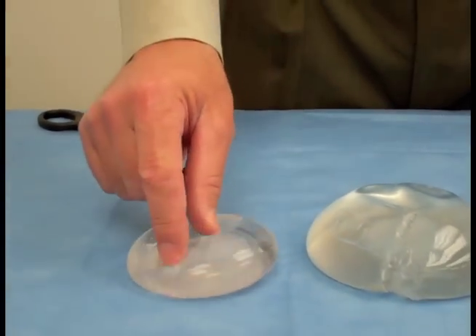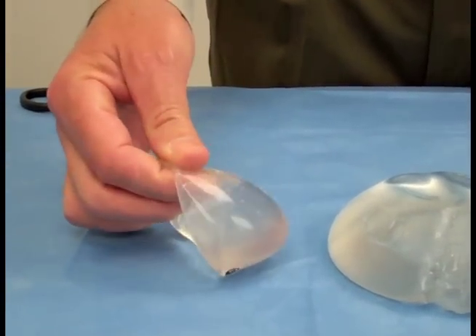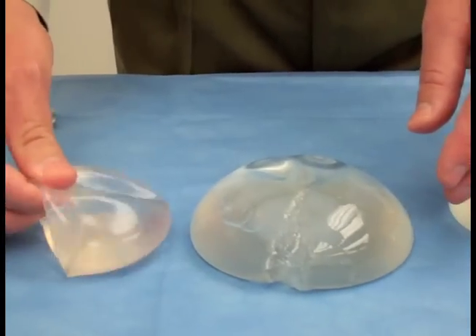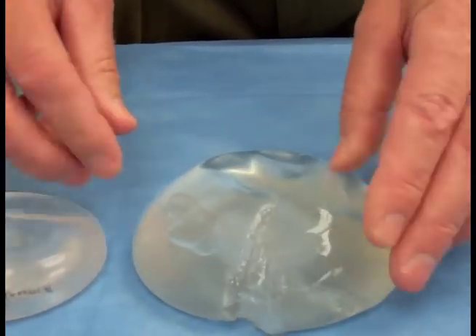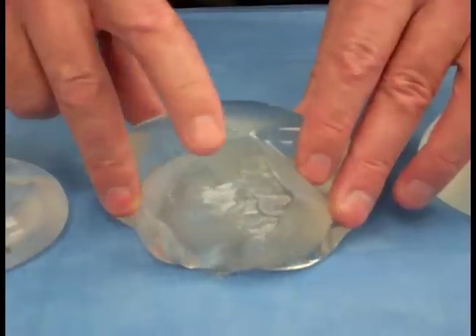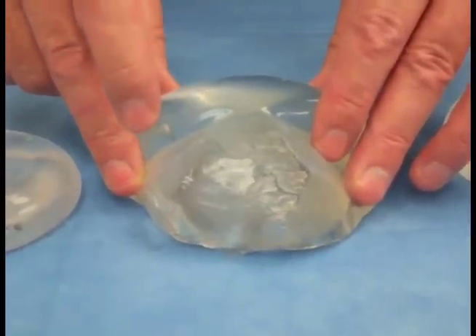This one here has saline fluid. They have similar shells on the outside — this is a silicone implant with a silicone shell, and this is a silicone shell on the outside of this implant as well. When you cut into the silicone implant, the silicone material inside is the same as on the outside, just polymerized a little bit differently.